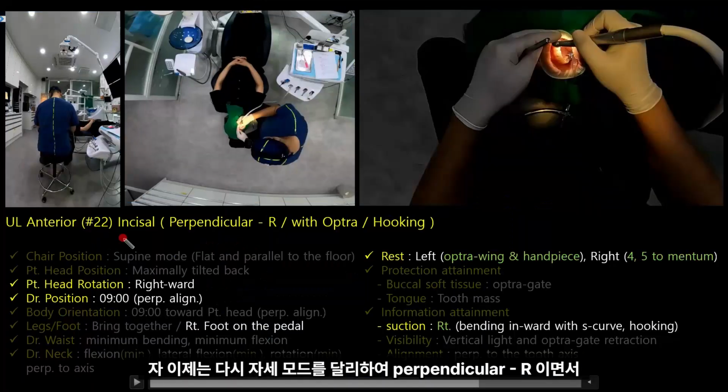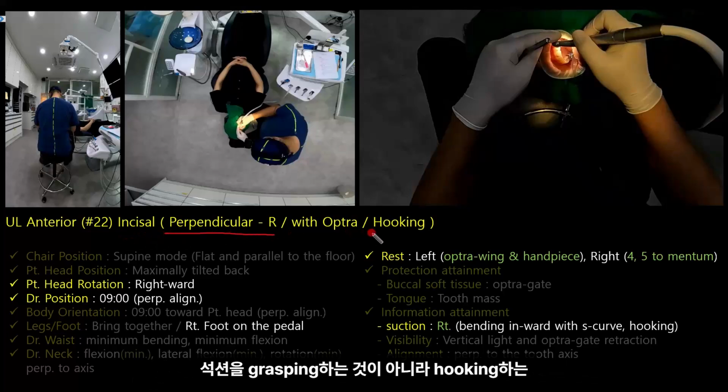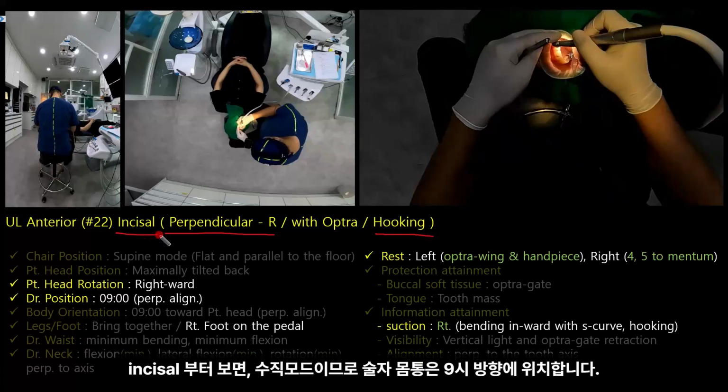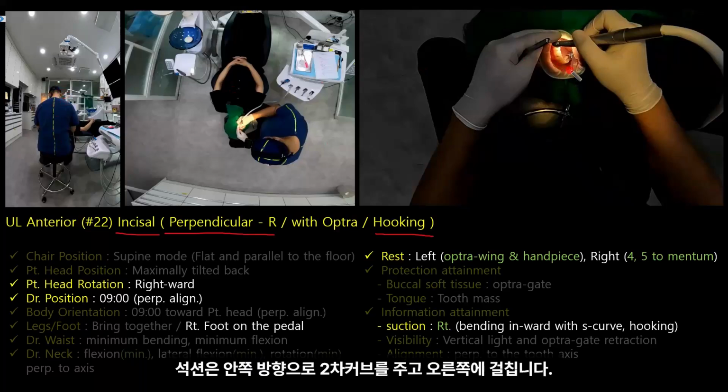Now, let's change the posture mode once more and explore the category of settings for the perpendicular R position, where we'll focus on hooking the suction onto the oral angle instead of merely grasping it. Starting from the incisor, in the perpendicular mode, the operator's body is positioned at 9 o'clock. The patient's neck and back are positioned within a comfortable and stable range. The suction tip is curved inward and then securely hooked onto the patient's right oral angle, creating a secondary curve.